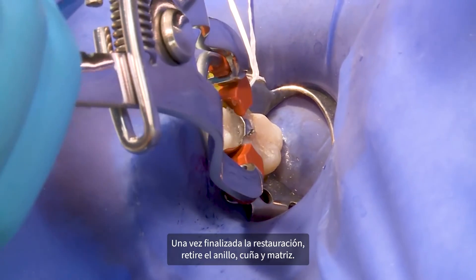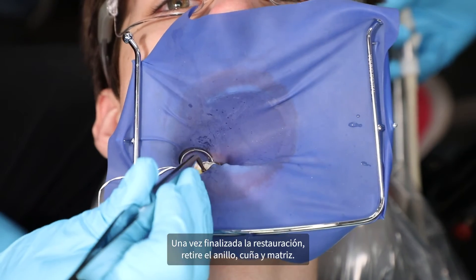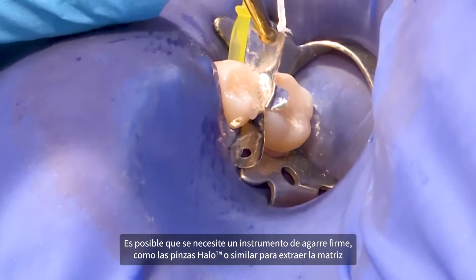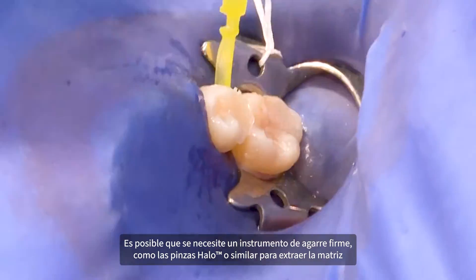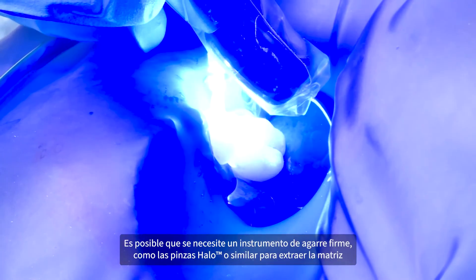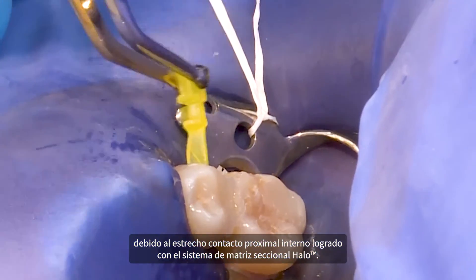Once the restoration is complete, remove the ring, wedge, and matrix. A firm gripping instrument, such as the HALO pin tweezer, oral hemostat, or cotton pliers, may be needed to remove the matrix due to the tight interproximal contact achieved with the HALO sectional matrix system.